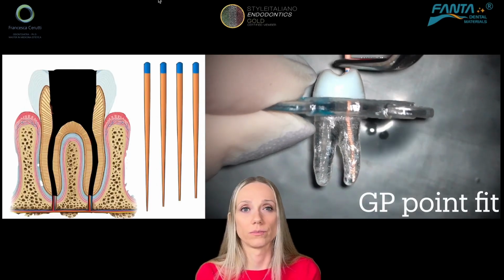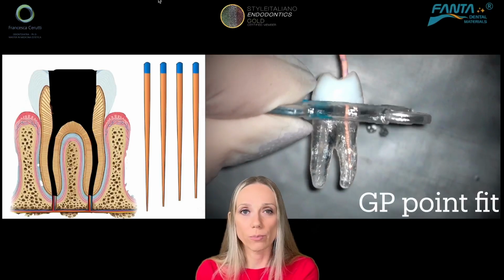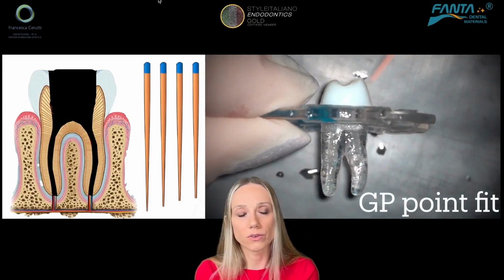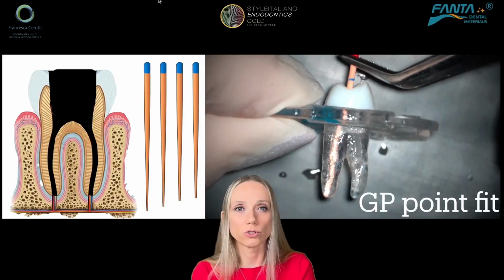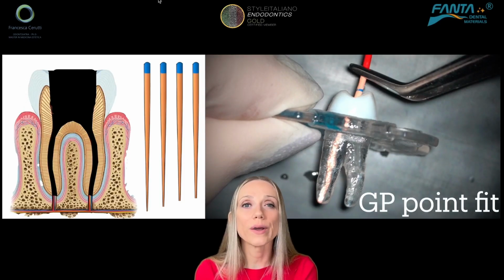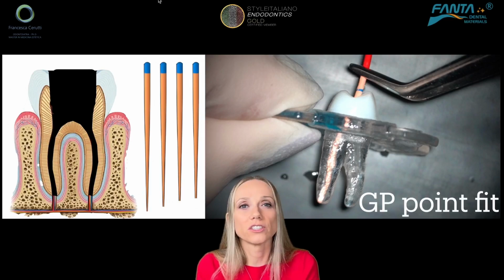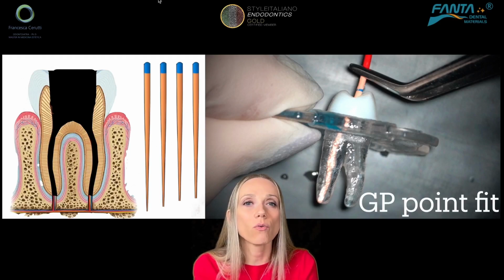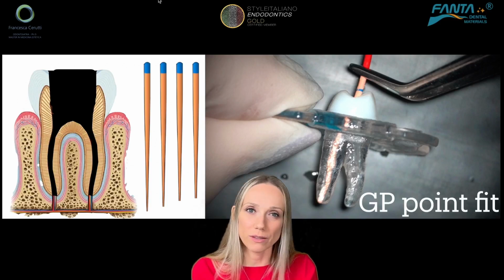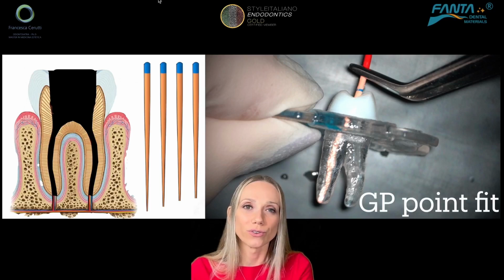How do I do it? Step by step. First of all, I need to check the fit of my gutta-percha point. This is something that we underestimate sometimes because maybe we use customized gutta-percha points for the instrument that we use to shape, etc. But we also always have to check the gutta-percha point fit, because, for example, if I just got distracted, I stayed too long with my shaping instrument at the apex and I went a little bit over my working length, the diameter of my apex will be different from the diameter of the instrument that I use. It will be bigger, and so maybe the gutta-percha point is going to go over the apex.